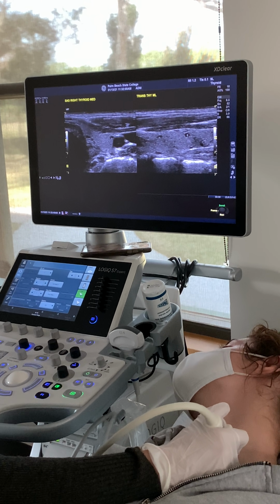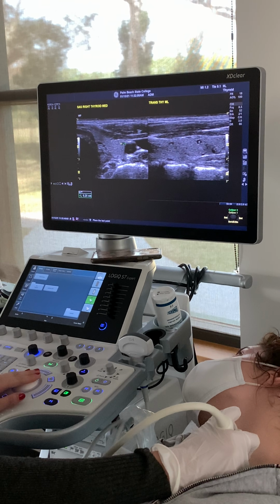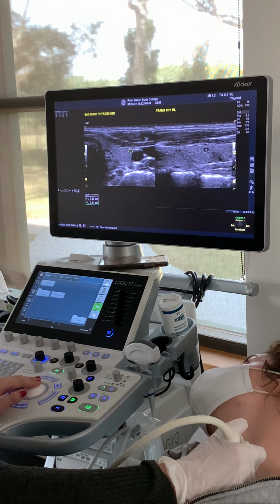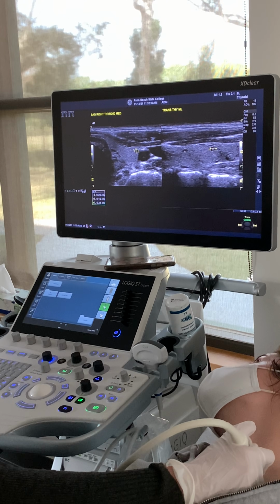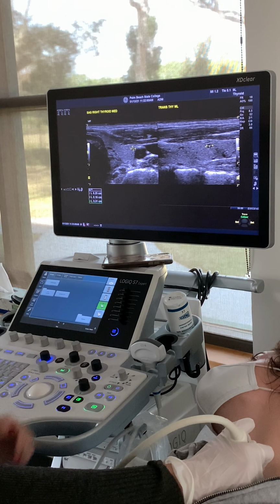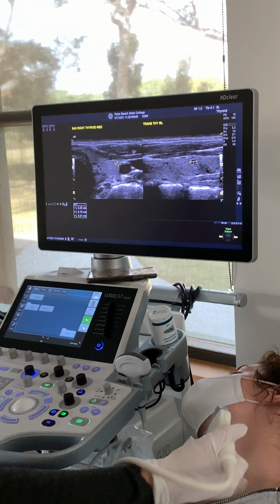radiologists. Patty, I think they actually changed the TIRADS. They did? Yeah, now you measure in transverse. This is like the only organ that in transverse, if you see something, you're gonna do the 2 measurements in transverse. Okay. And then the 1 in sag. They just changed that last year. Okay. But you would make sure that you always have 3 measurements so you get a volume of whatever. Okay. And then that's it. That's your whole thyroid protocol. Not too bad, right?